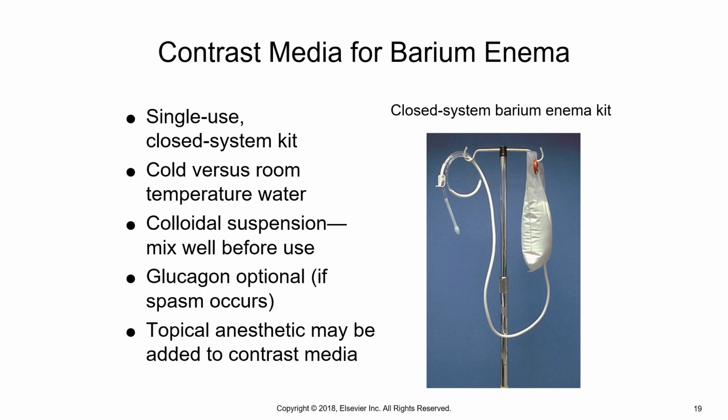Typically, when we have a barium enema study, we have a barium enema kit. Sometimes that kit would look like this bag here on this IV pole. Sometimes it'll come with powdered barium in there, and then we add water through this hole up here, and this is closed off when we start, and then we would mix that, and then you would run the barium down the tip and clamp it off so that it didn't run out.